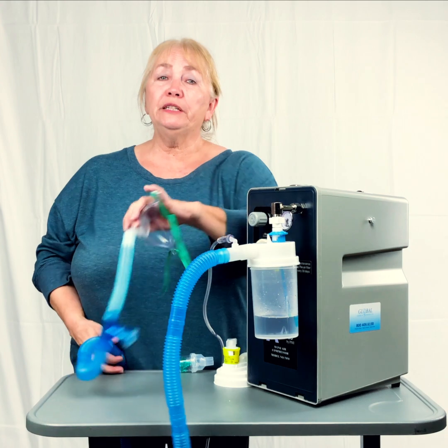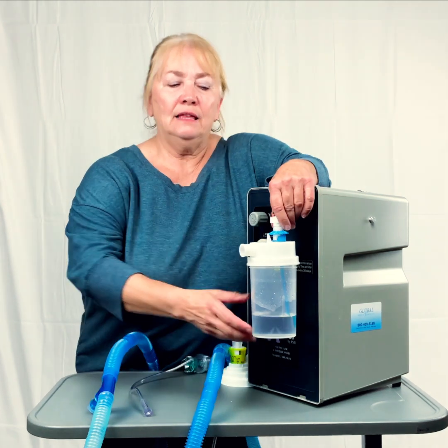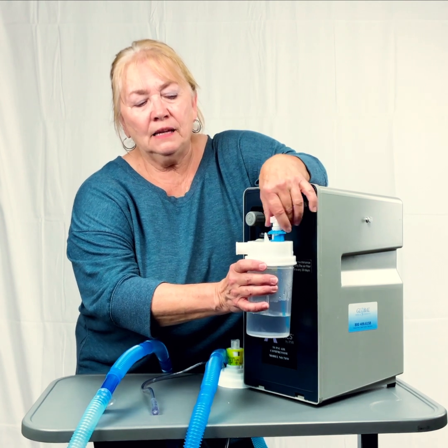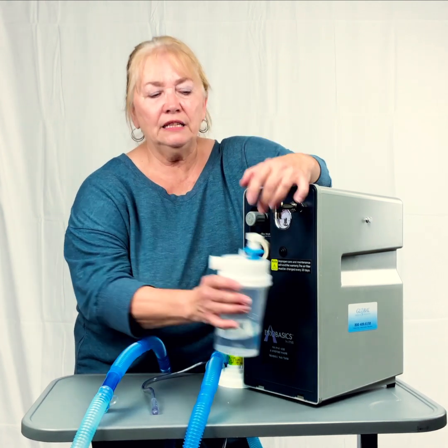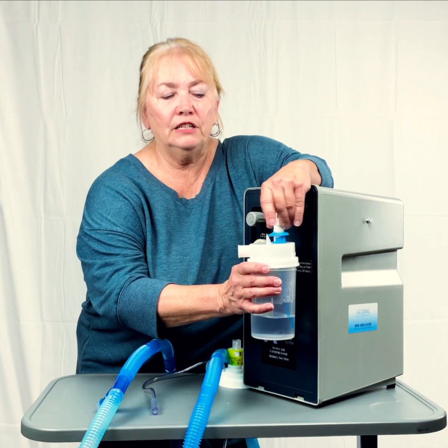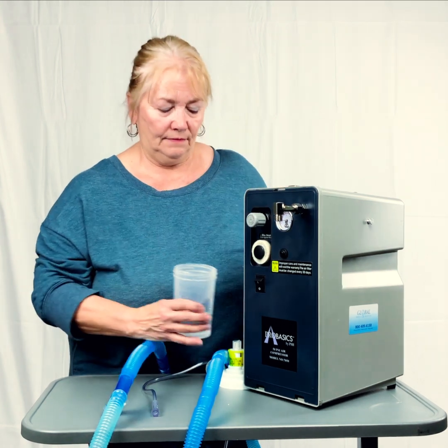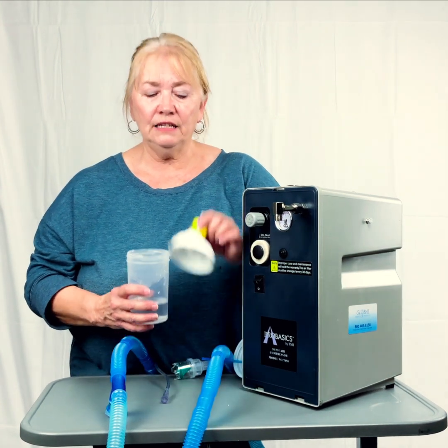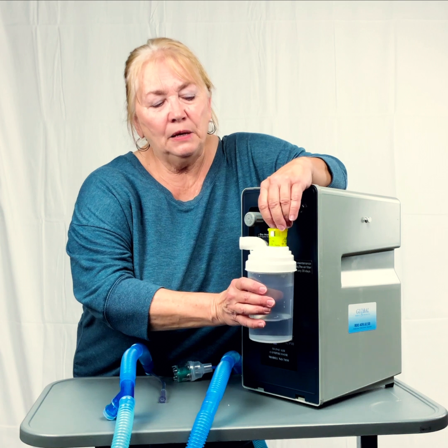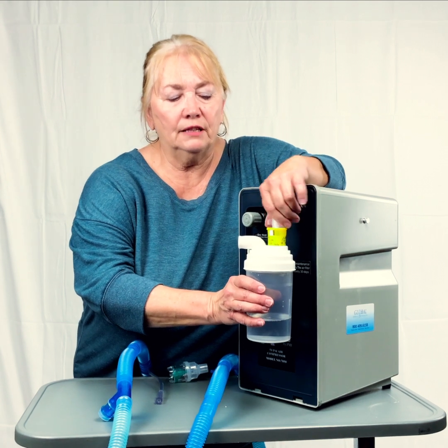All right, now we're going to do a little bit of troubleshooting. If you call and you say, the water bottle's not making mist, a couple things have happened. Sometimes you have trouble getting this screwed on straight. So you have to take it off and redo it, and take it off and redo it. Sometimes the bottle's not screwed together correctly. That can happen. It happens more often than not if we have a problem. And again, depending upon who you're getting your supplies from, the top might be a little bit different, but they all have numbers on them.